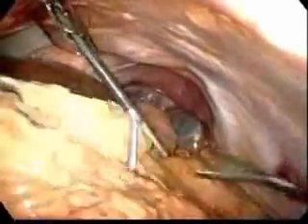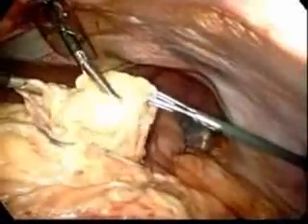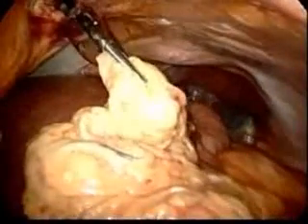The upper trocar site is enlarged slightly, and the omentum is then grasped and pulled out of the abdomen for use in the infected sternal wound, which will be debrided and then skin grafted by both cardiothoracic and plastic surgery. As you can see, this flap consists of quite a bit of omentum, which can fill a large defect.